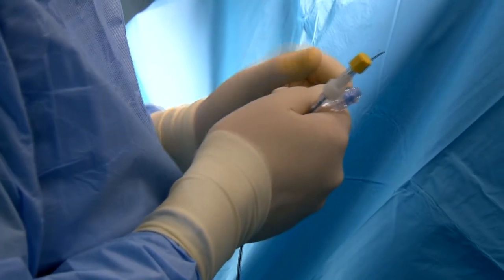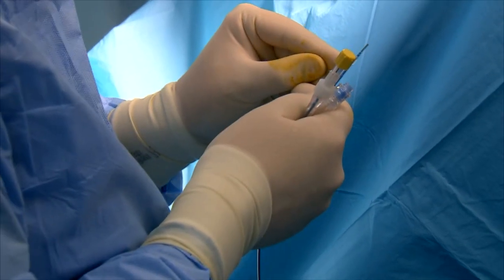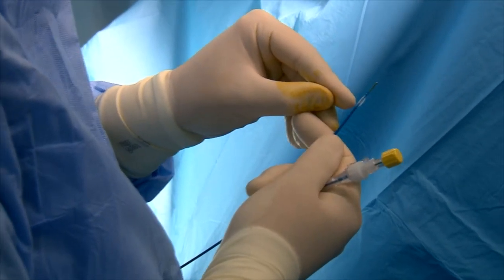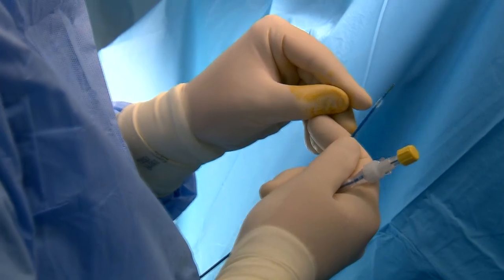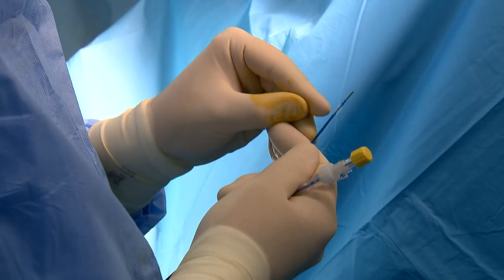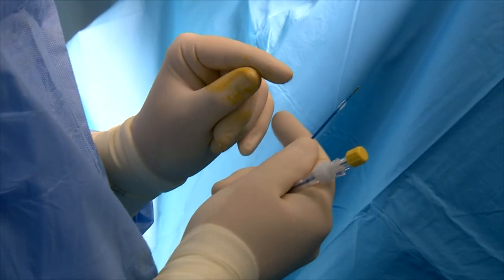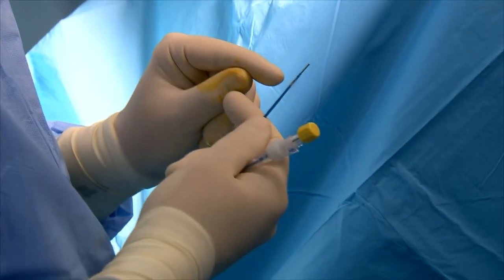The fourth feature is that there is a metal ring. Please, could you show this detail? Yes, we see it very well. This metal ring is very good if you want to know the position of the balloon without applying contrast dye in fluoroscopy.